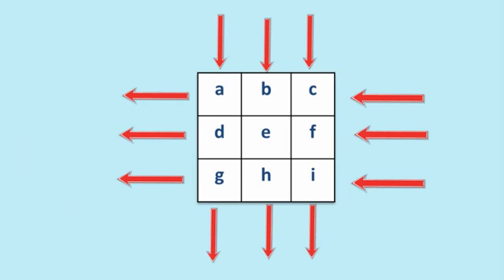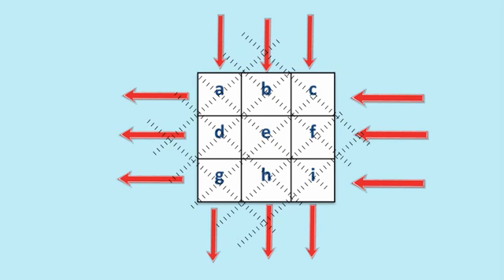Because of course we need to get to a unique CT scan, because the doctor doesn't want us turning up with 6 CT scans and saying, well, it's one of these, but I'm not sure which one. So if we go back to where we had the X-rays going horizontally and vertically, the way to solve this problem is to start using the diagonals. And you can see there's lots of diagonals. I think there's about 10 diagonals. So by taking enough diagonals, we can get to a unique solution.